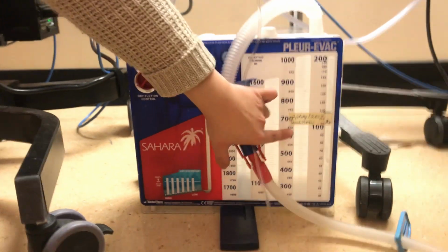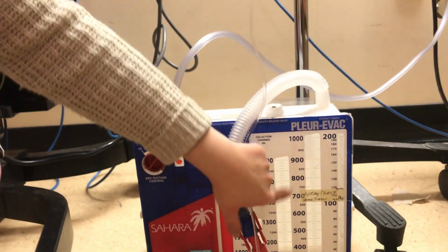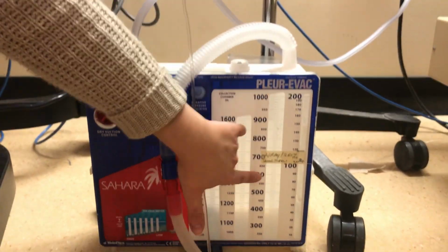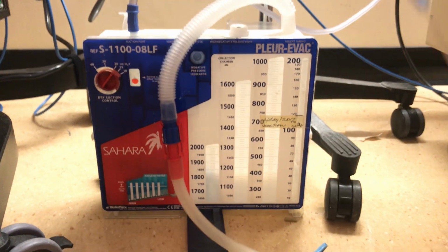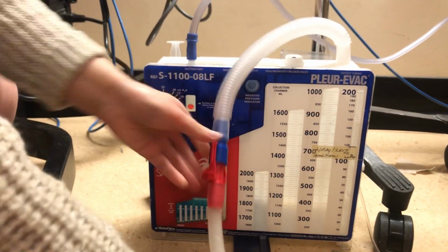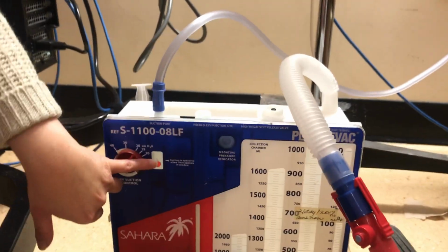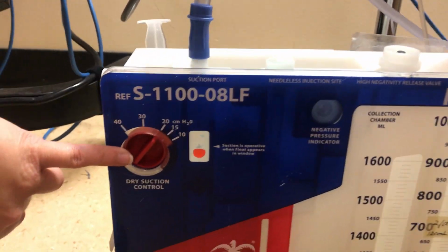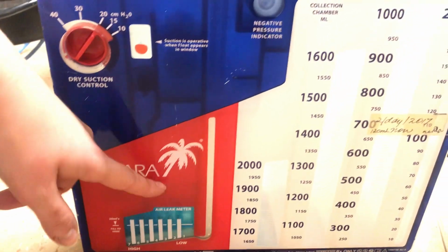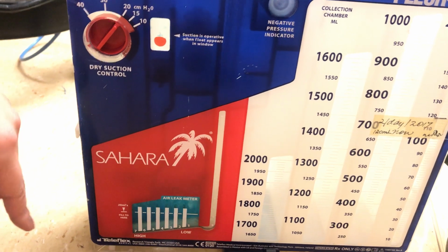So at the start of the shift, I'm just going to measure and initial where I see the amount of secretions, and I'm going to take note of its quality. And I'm going to check that this is all intact. I do see the orange floating ball, which means it's working. It's at 20 centimeters of water. I would look for gentle tidaling that coincides with the patient's respirations.